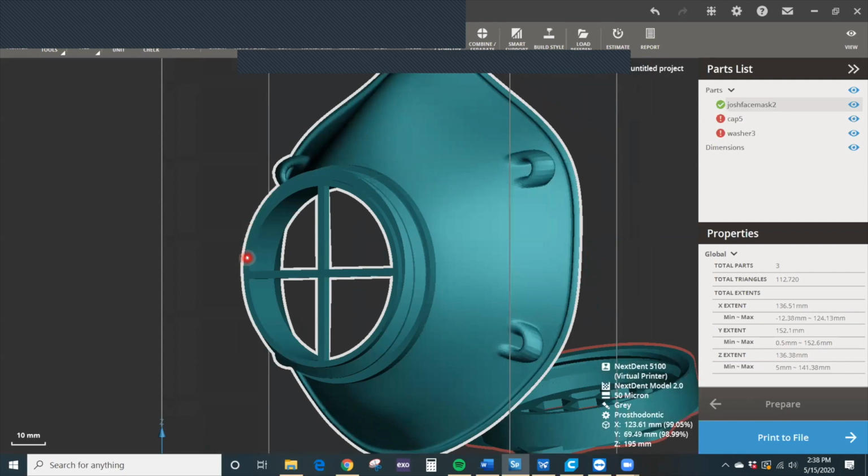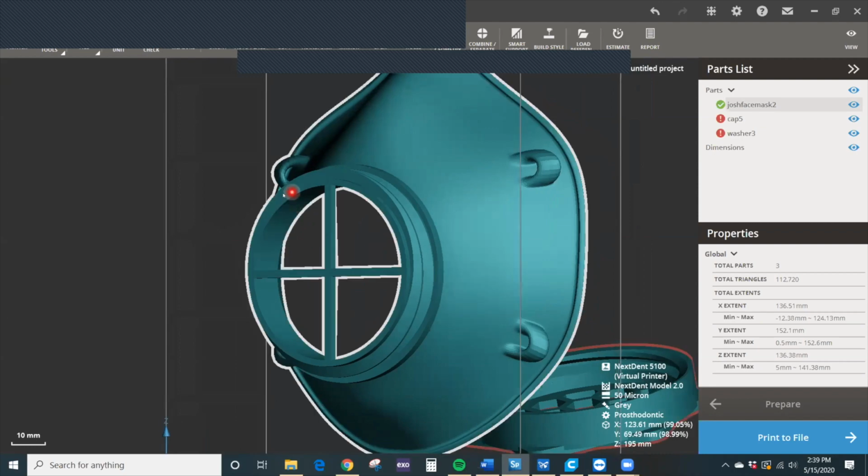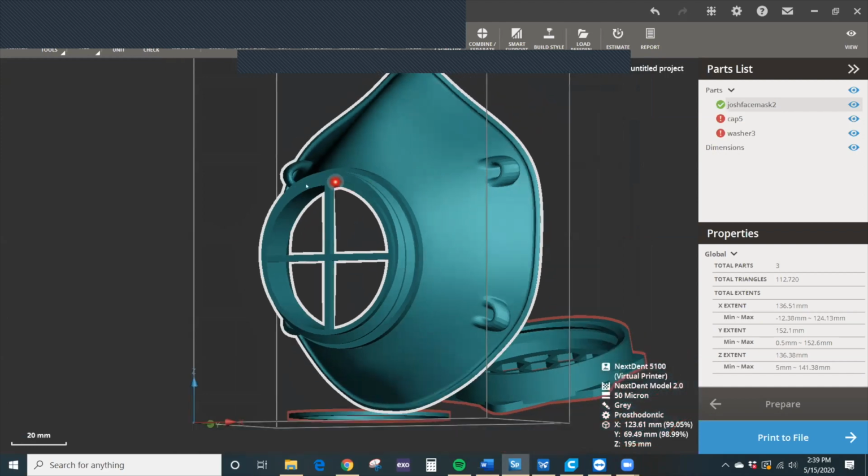We want to make sure that we do not add any sprues on the sealing surface here. Now, if you do end up adding some sprues there because it was absolutely necessary, it's not the end of the world, right? You'd want to take certain precautions and make sure that you're able to remove the little nubs left behind from the sprues as much as possible without damaging the contour of the overall sealed area here. So this is one crucial area where I would try to minimize the amount of sprues.